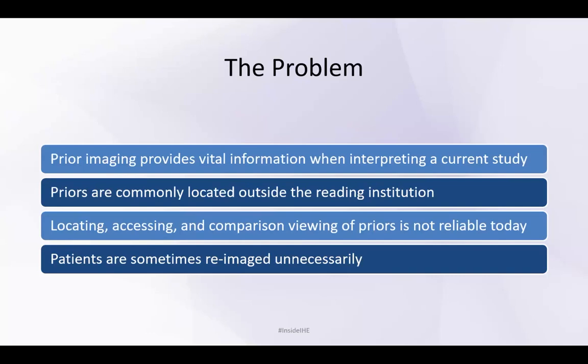Also, we need for accuracy and speed to cross-reference the CT slices and MPRs in DICOM format, and Dr. Smith will want to use his own measurement tools. Dr. Smith wants the remote CTs to be readily available in his patient file on his own PACS and wants the studies displayed using his hanging protocols. He wants the report to be available the same way that he displays the previous report for studies performed in his institution.